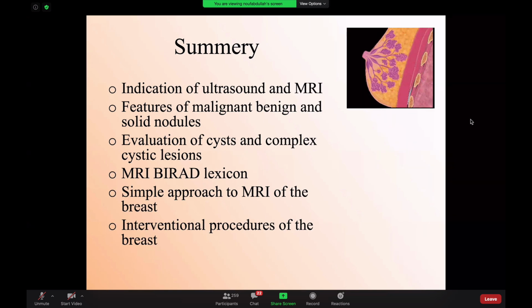Okay. Dr. Muhammad asking, can I use BI-RADS system depending on one modality? No, because when you use mammo and ultrasound or ultrasound and MRI, you have at the end to give a conclusive assessment BI-RADS. So for example, if the patient is coming for screening only mammo, then you will give BI-RADS for the mammo. But when she comes for mammo and you do ultrasound, at the end, you cannot leave the mammo BI-RADS 2 and the ultrasound BI-RADS 4. The final assessment should be the highest. So I always give at the end 1 BI-RADS for each breast.